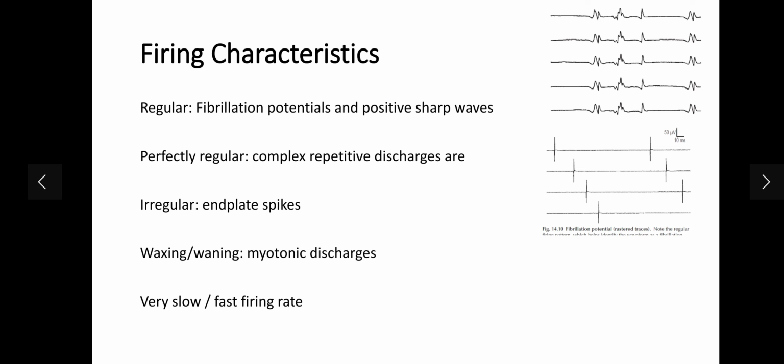And we also look at the firing rate. Some waveforms are very slow, like fasciculations, and some are very fast.